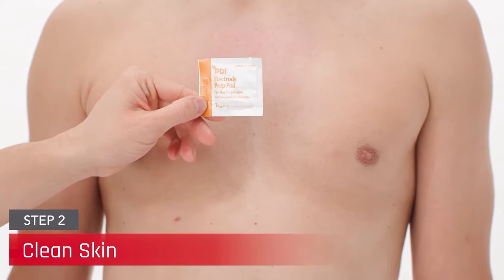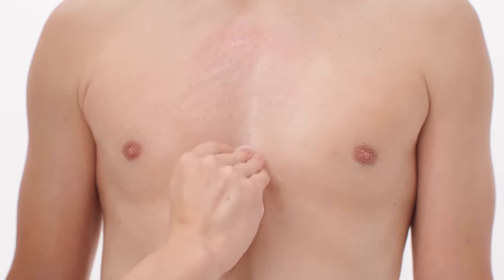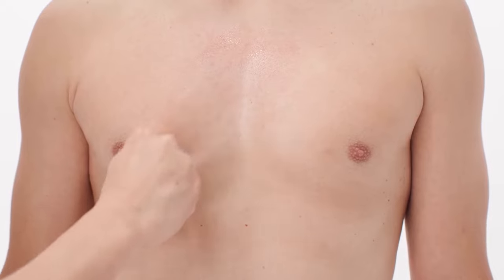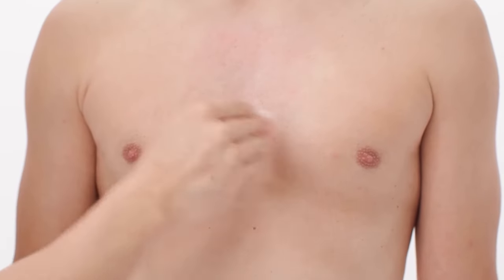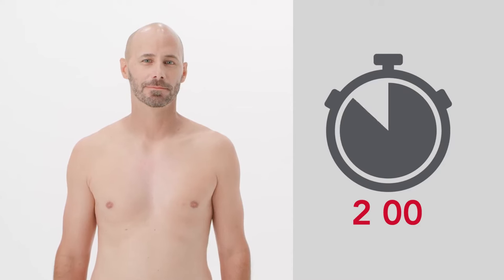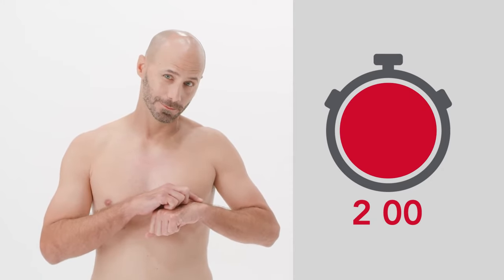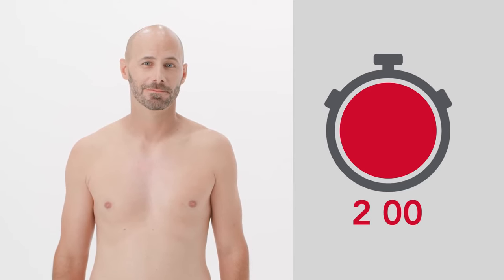Continue the skin preparation process by thoroughly removing dead skin cells. Using all three prep pads included in the box, scrub the skin well enough so it is slightly reddened, but not raw or painful. After cleaning, allow the area to dry thoroughly without touching it before applying the CAM patch, as skin oil on the fingertips may transfer to the application site and interfere with ECG quality.